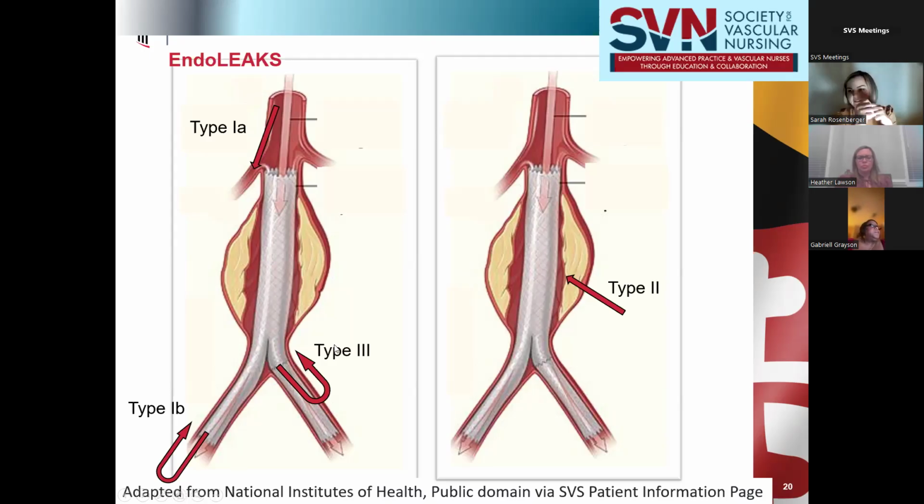And it happens when the stent folds on itself, or if the aneurysm, as I mentioned, gets longer, it pulls the aortic components apart, because you can imagine this part is adherent to the iliac artery, and this part is adherent to the aorta. So if this segment gets longer, those two pieces can be pulled apart.